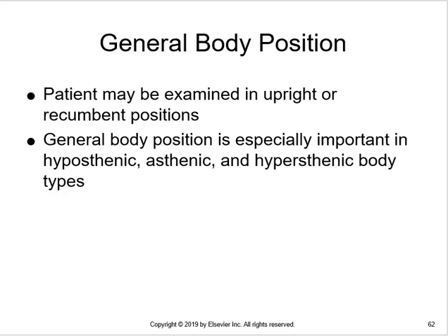You need to consider body position. Patient may be examined upright or recumbent, either one, but consider their history. If they've fallen because they got dizzy and they fell down, it's probably not a good idea to stand them up. If they come to you already on a stretcher, it's probably a good idea to go ahead and take the images with the patient laying down. Certainly if the patient is on a backboard, you don't want to move them off of the backboard to do skull views unless they've been completely cleared of the backboard, in which case they should not come to you on a backboard.